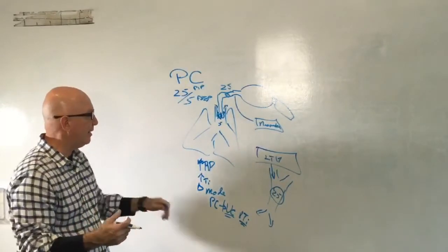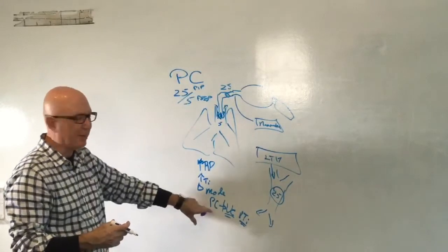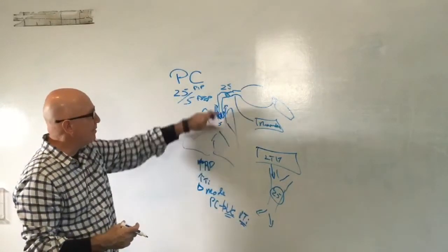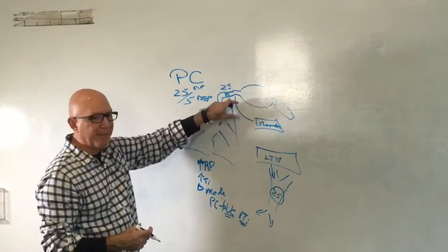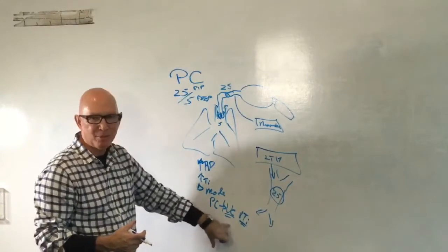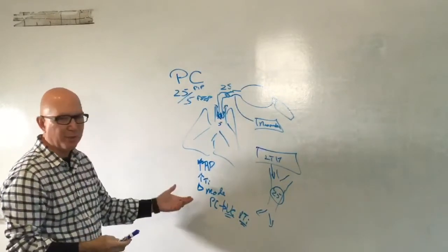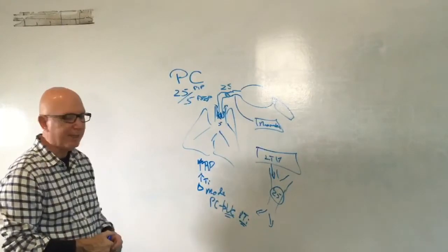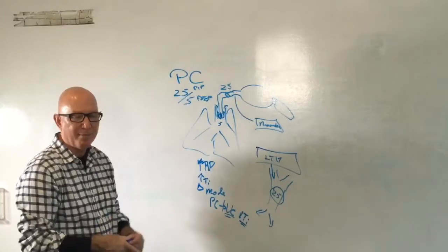Now, this is not something that I've had to do before because we didn't volume ventilate our neonates. But in consideration of what happens between a mechanical breath and a manual breath, this is one way to try to mimic what is going on between those two. So it could be another option that might get you to where you want to go in that particular situation. And if that fails, then the next piece might be manual ventilation.